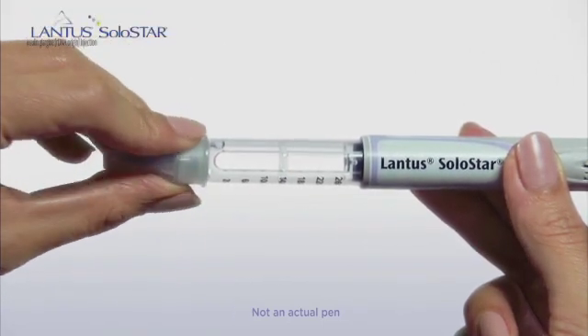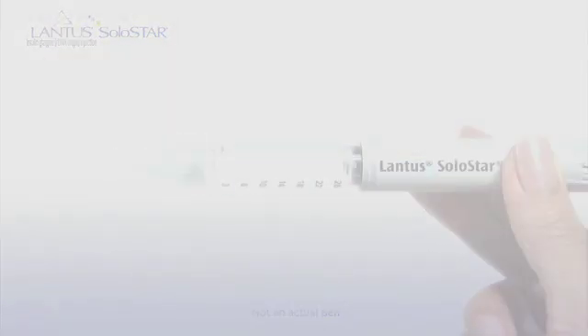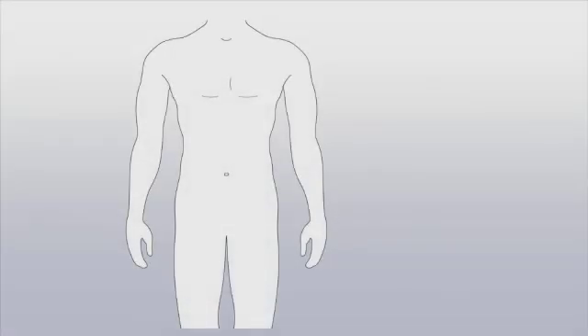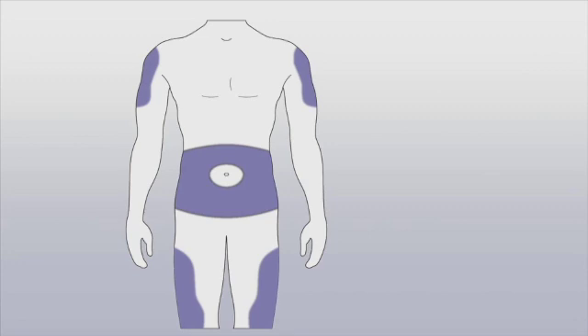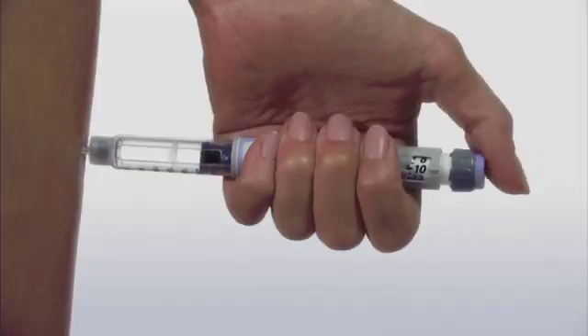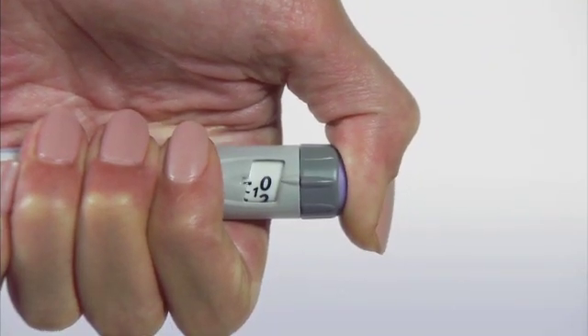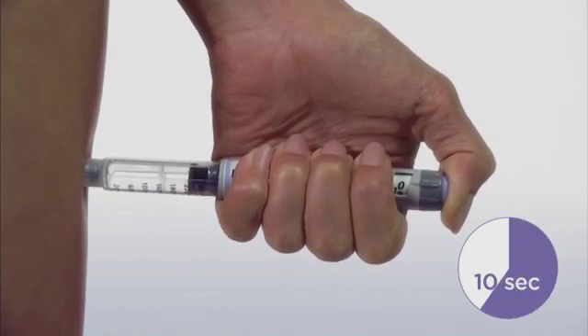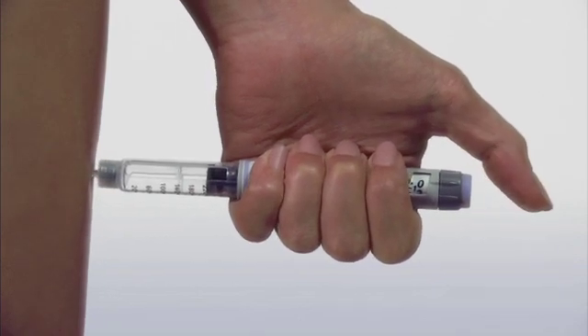Use a new pen needle if you need to give yourself another injection. You must always attach a new needle and discard the one you just used. Now let's go on to Step 5, Injecting your Dose. Injecting with the Lantus Solostar pen is easy and takes seconds to do. The pen uses a very thin needle that you can inject in the upper arms, the abdomen, or the thighs. Keeping the pen straight, insert the needle into your skin. Using your thumb, press the injection button all the way down. Then, slowly count to 10 to make sure that you get your full insulin dose. After counting a full 10 seconds, release the button and remove the needle from your skin. Congratulations! You've learned how to inject yourself with the Lantus Solostar pen.